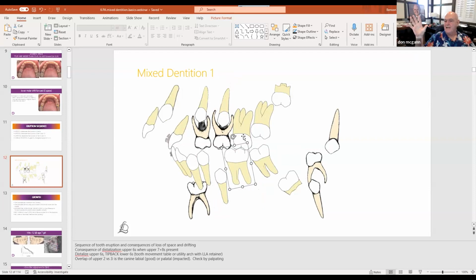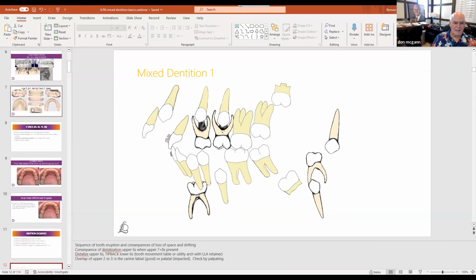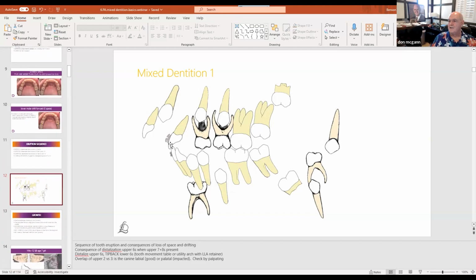Okay, so you're asking what's happening with the drift of the upper molar. Now, the upper molar I mentioned rotates. I can't rotate that here in this direction, but it rotates mesial palatal, like I just showed you on this slide. There's another one coming up. I'll show you when it's coming up here. There is a molar rotation, right?